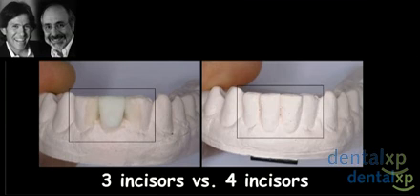So one of the questions that I had to ask David is, do you think we should plan this case to replace the 2 incisors with 1 incisor or with 2 incisors, giving the patient 3 incisors or 4 incisors as a final goal? And obviously, surgically, it's much easier for us to put a single implant in. And I was contemplating doing a little bonding on the adjacent to the lateral and the central, as you can see. And the idea there would have been much simpler.